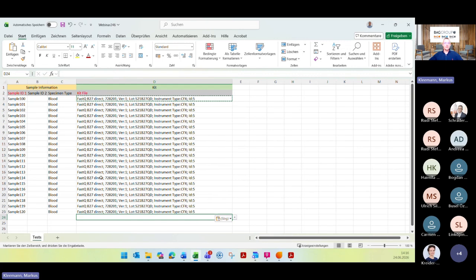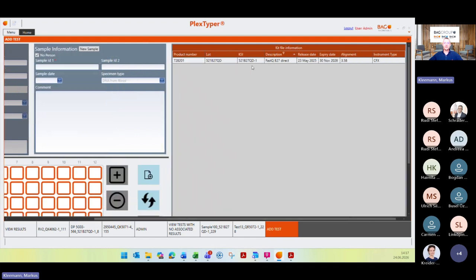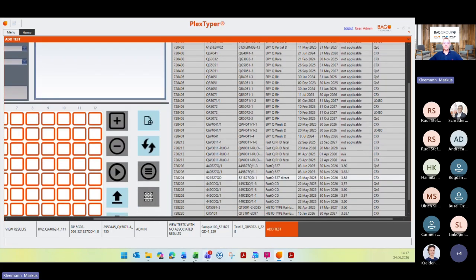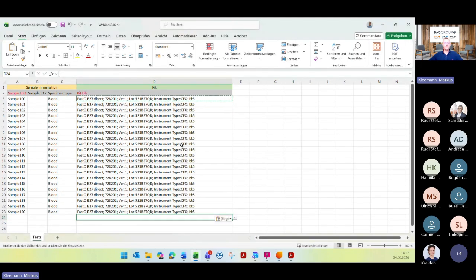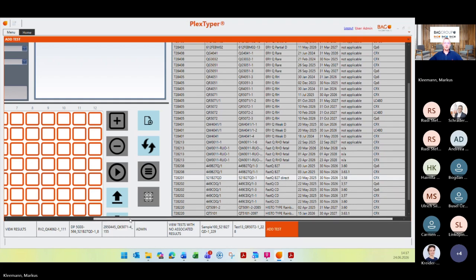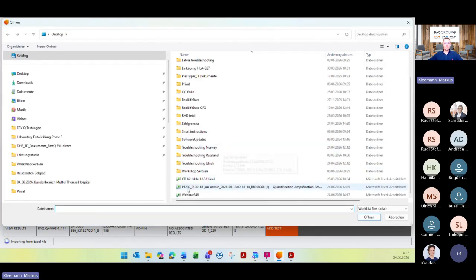You can reuse this Excel work list for different runs, but one important thing is you have to be careful when you upload a new kit file to your PlexTyper. Then it is important to download a new work list again, because otherwise this kit file is missing here in this table. So then I will save this Excel work list. And another important thing is that you have to close this Excel work list before you can upload it in PlexTyper. So I move back to my PlexTyper software, and now you click this arrow. I open the webinar work list from my local server.